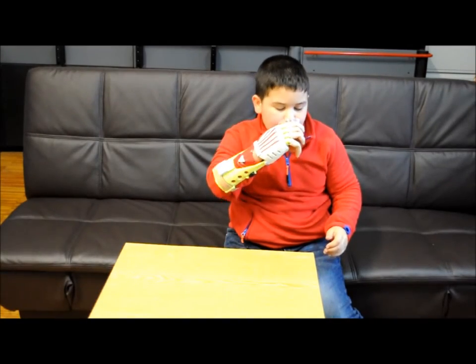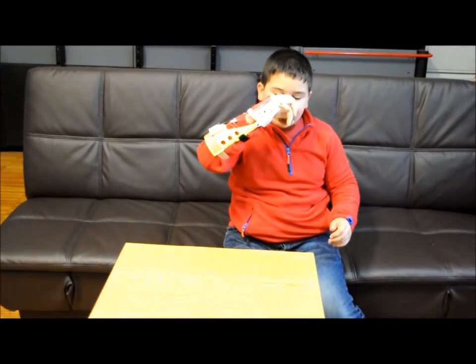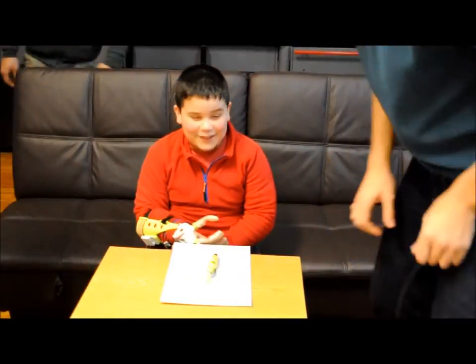For instance, the user can grasp a cup and drink, grasp a spoon and eat, grasp a ball and play, and grasp a pen and write.